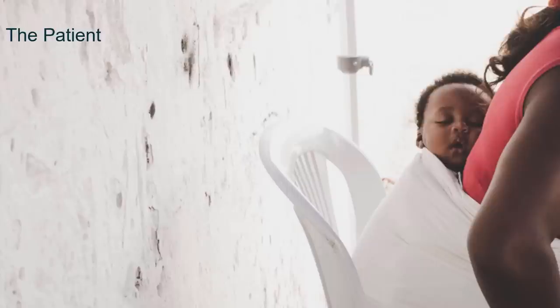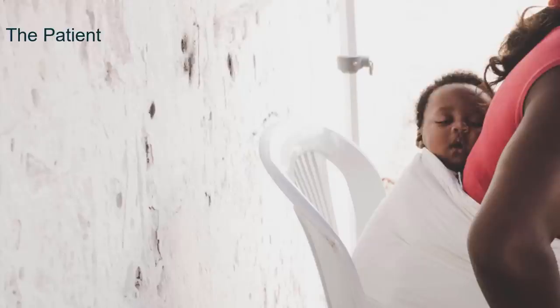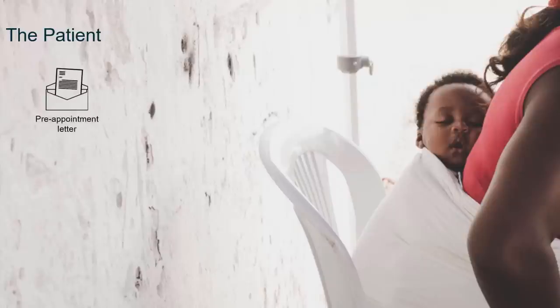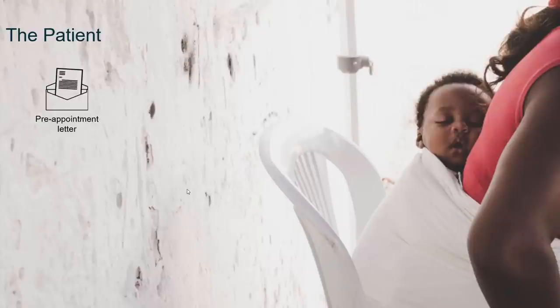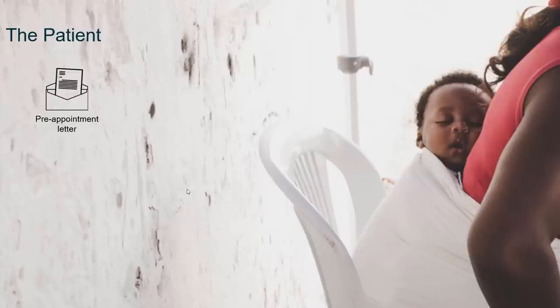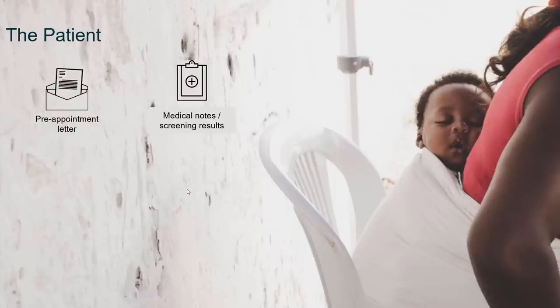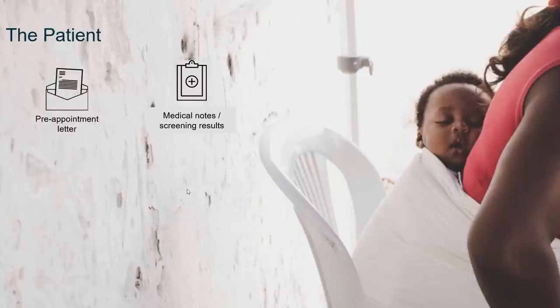Let's break down each component, starting with the patient. If you're doing a threshold ABR, it's really important to do a couple of steps before the appointment begins. The biggest one is to send out a pre-appointment letter detailing what's going to happen, because this can be a worrying time for parents. The more information you can give them beforehand, the more successful the appointment will be. Secondly, look at the patient's notes before they arrive — this is useful particularly if they've had a newborn hearing screen, as it will help you know which ear to test and any other considerations.